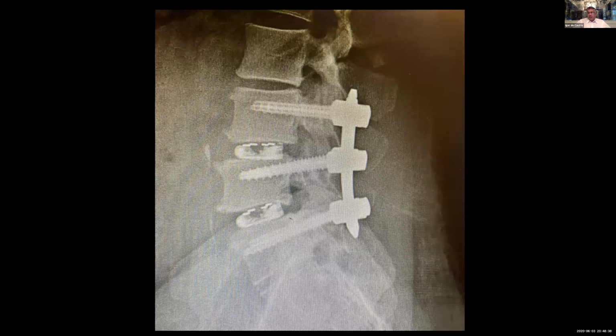This patient was really fun. And the reason I put this slide: I always show pre-op and post-op pictures to my patients, and I showed this slide to the patient. He looked at me and said, Dr. Castro, you said you're going to put 2 rods, and there's only 1 in there. So you have to show the PA; this is just a very good precision on the lateral. The patients nowadays, they question everything.